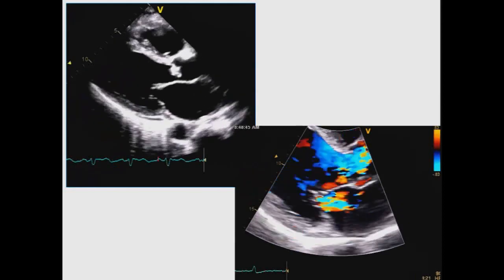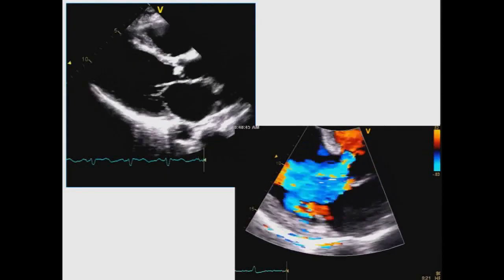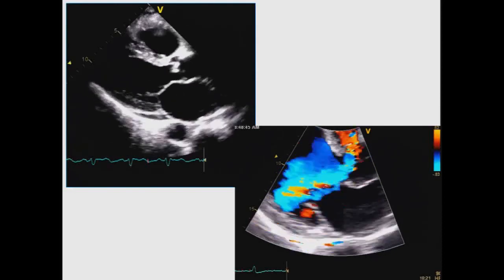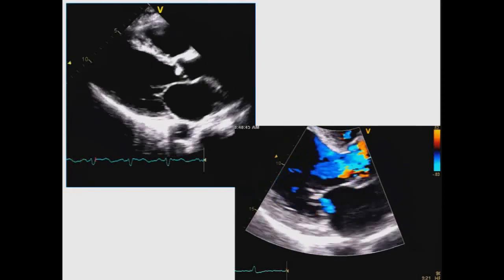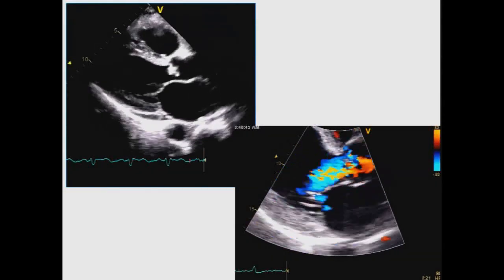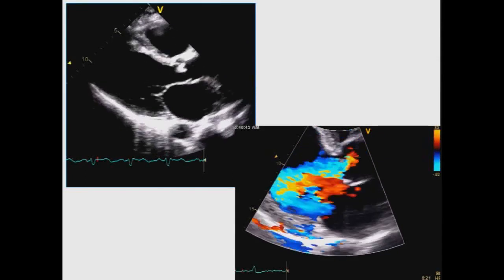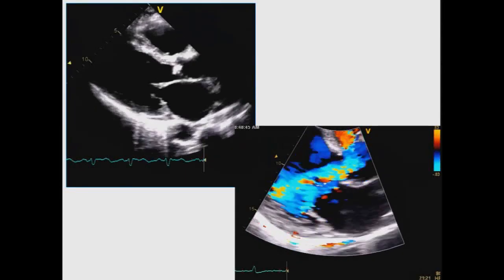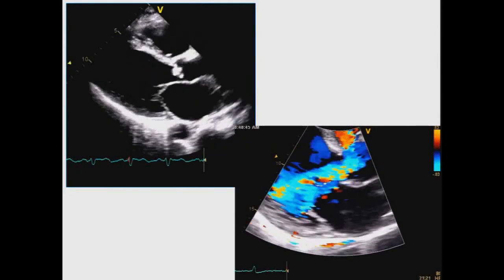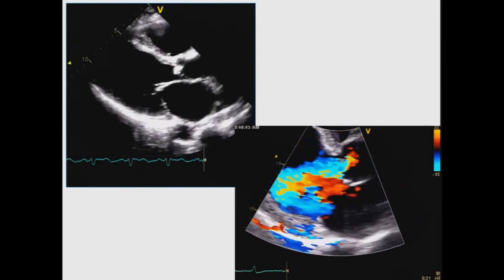On the other hand, if you have a patient who has secondary or functional mitral regurgitation, generally the usual diastolic measures do allow you to predict filling pressures in such a patient. So that's how I would answer that. I don't think it's as much the degree of mitral regurgitation as what the etiology is. Generally, the diastolic function assessment will work if you have heart disease. It doesn't work as well if it's, say, a flail leaflet, but no underlying myocardial disease.